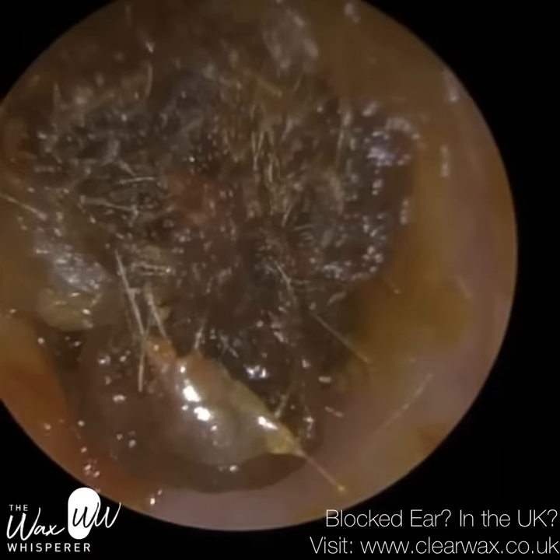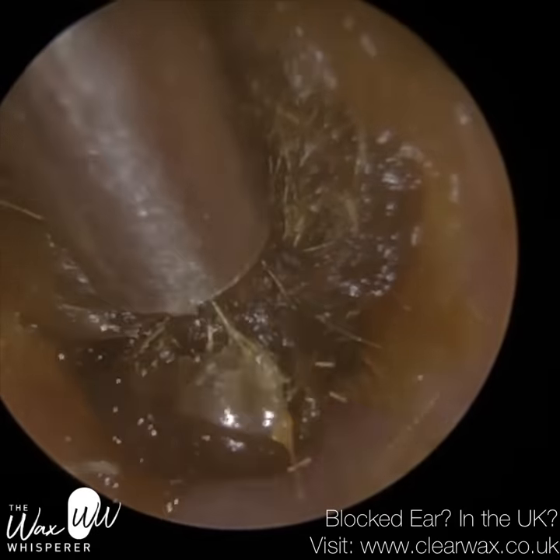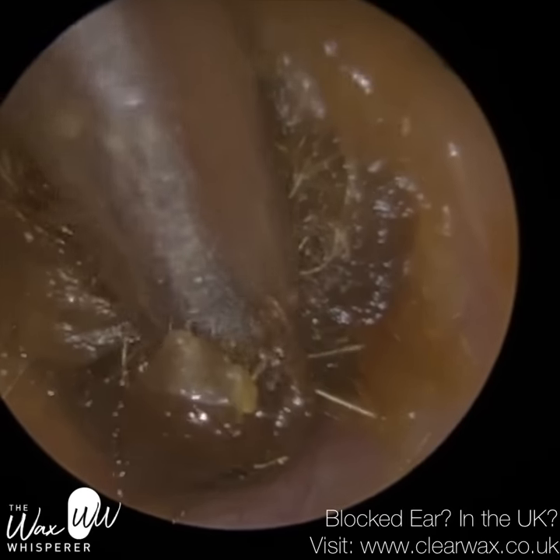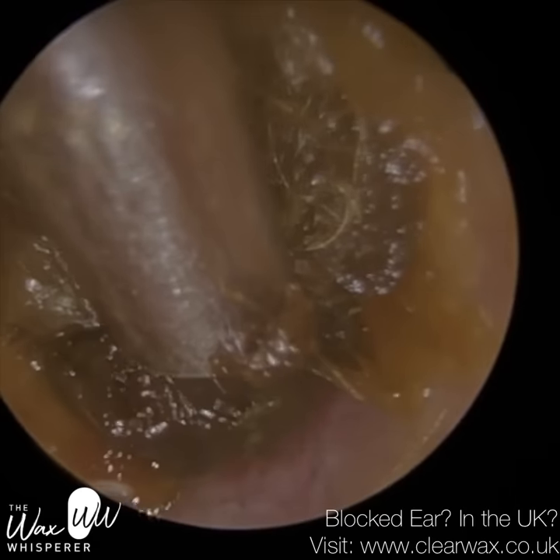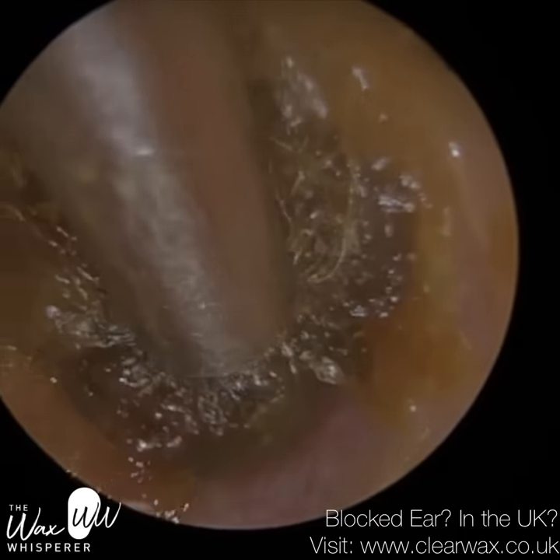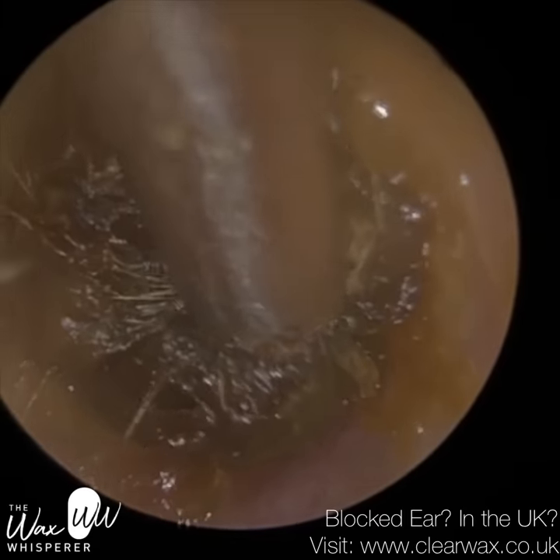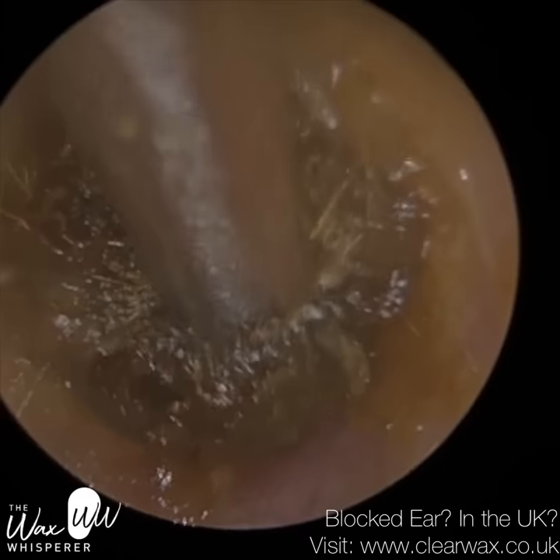And now I can see, as I said, all around the edge, I can see the ear canal. This is why an endoscope is so brilliant, the field of view that it provides. And I personally feel that there's no better method of viewing the inside of the ear when performing earwax removal than an endoscope. I've got an operating ENT microscope at my clinic. In fact, I've got several.